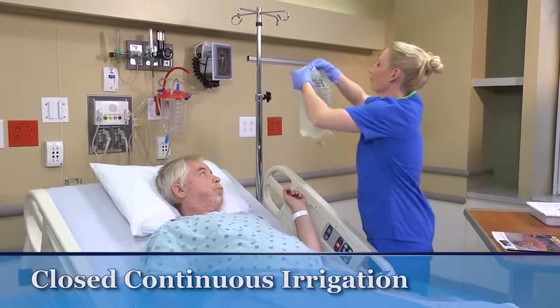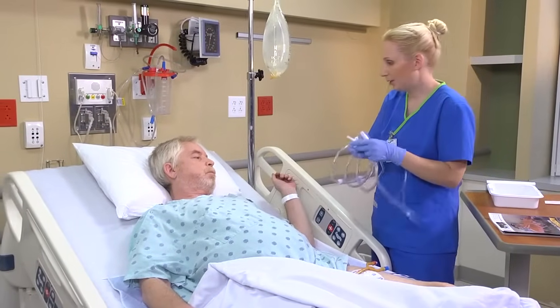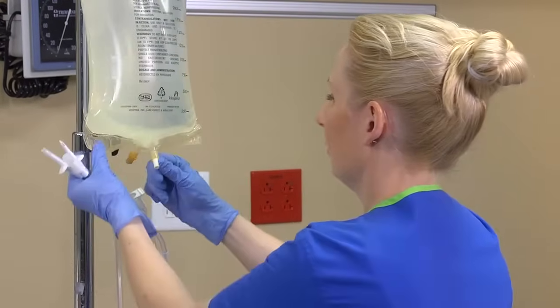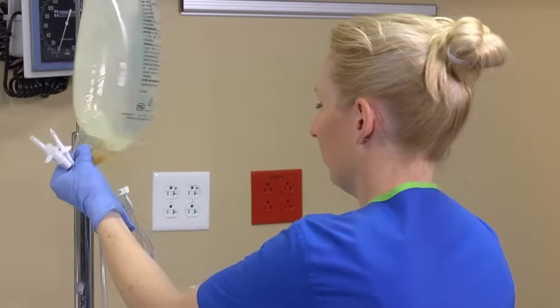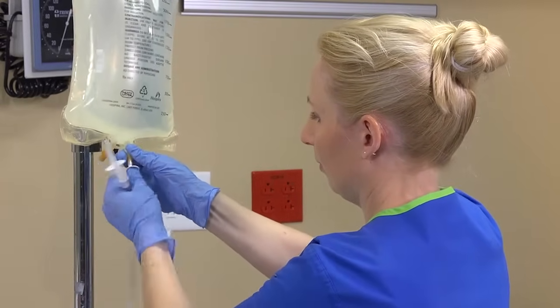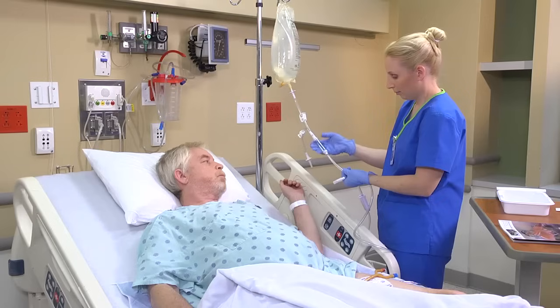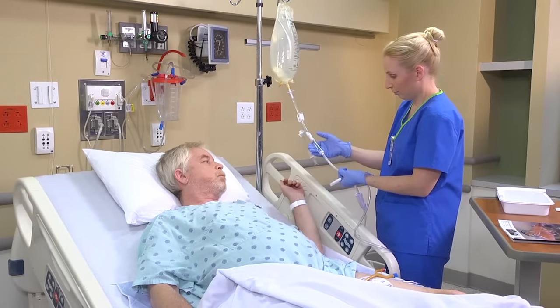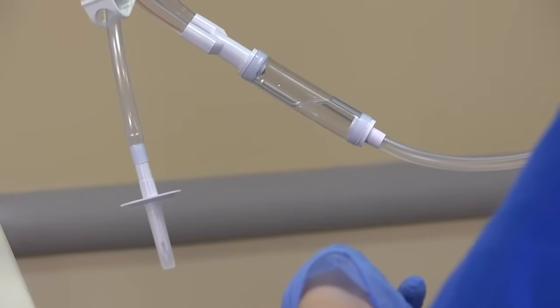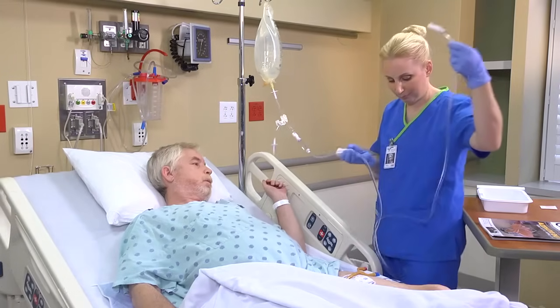To irrigate a closed catheter, hang a bag of irrigating solution on the IV pole. Using aseptic technique, insert the tip of the sterile irrigation tubing into the designated port on the bag of irrigation solution. Squeeze the drip chamber to fill it halfway. To open the tubing completely and displace the air inside it, release the clamp and allow the solution to fill the tubing. Make sure you keep the end of the tubing sterile. Close the clamp once the tubing is full.